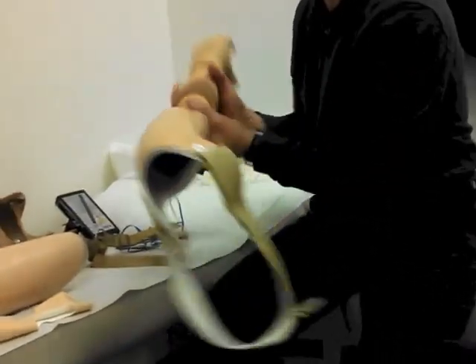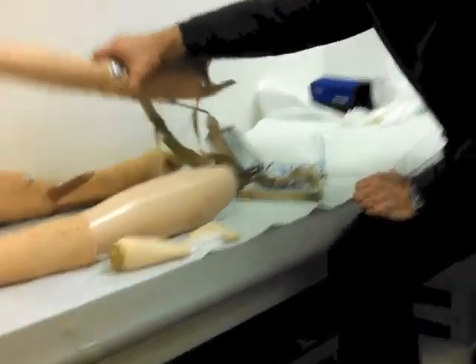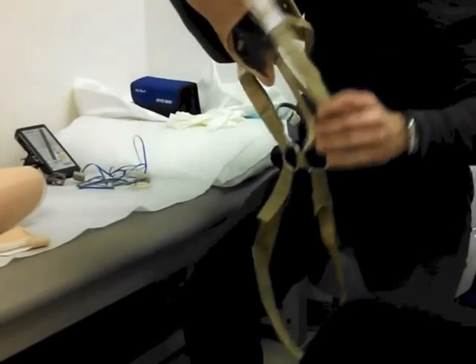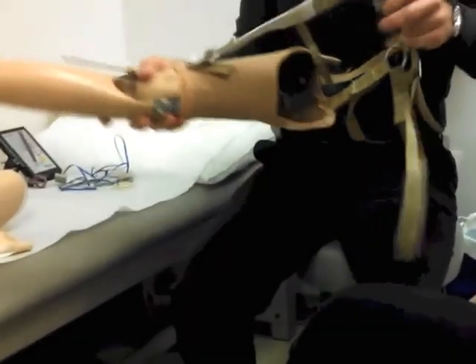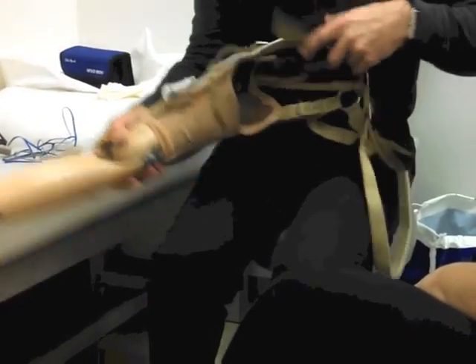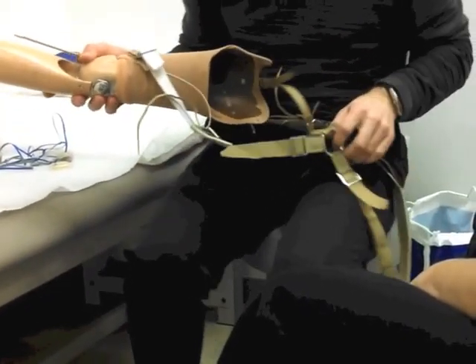You can have it with the pin system, you can have it with the harness, or this one here, which is a figure-eight harness, they call it. This looks like a lot of straps — and it is. This is the most common way a prosthesis is actually held on that you'll see out there.